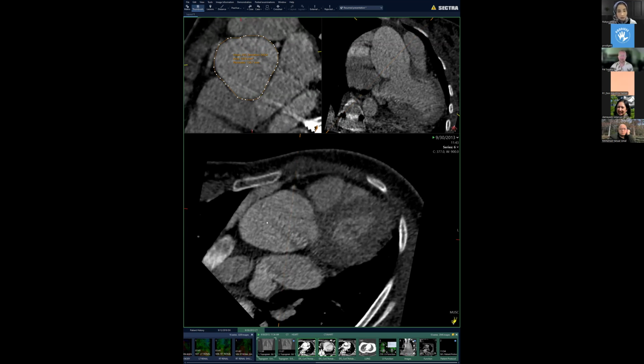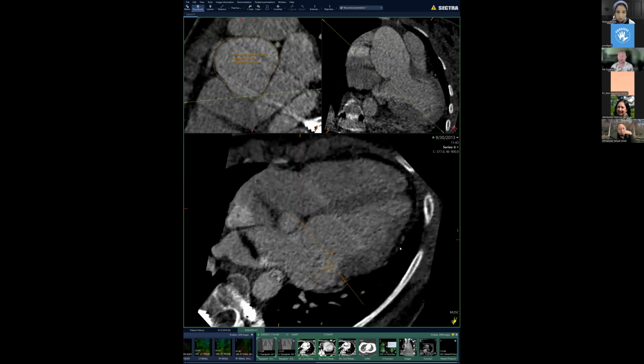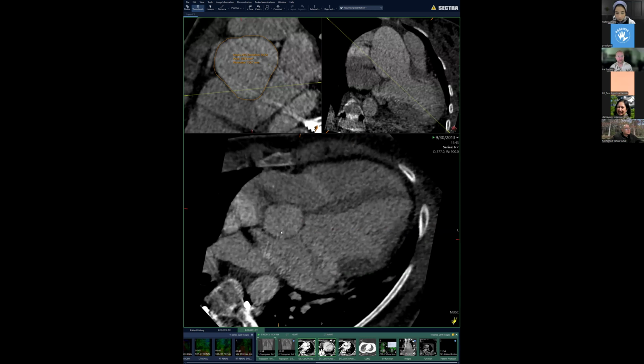So here, strictly speaking, the chest wall deformity is kind of an adjacent finding, doesn't directly affect the cardiovascular structures, but I wanted to show this case nonetheless because it's very important for us cardiac imagers to identify these abnormalities, even if the CT is done for, let's say, checking the hardware of the scoliosis. Mitral valve prolapse is one of those diseases that leads to regurgitation, and that regurgitation can kill the left ventricle slowly. And by the time the patient is actually symptomatic, it may be too late to do anything about it. And these are fixable problems. Both the aorta can be replaced and a dissection or rupture can be prevented that way.